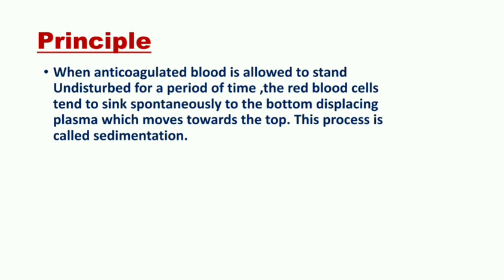When anticoagulated blood is allowed to stand undisturbed for a period of time, the RBCs tend to sink spontaneously to the bottom, displacing the plasma, which moves towards the top. This process is called sedimentation.